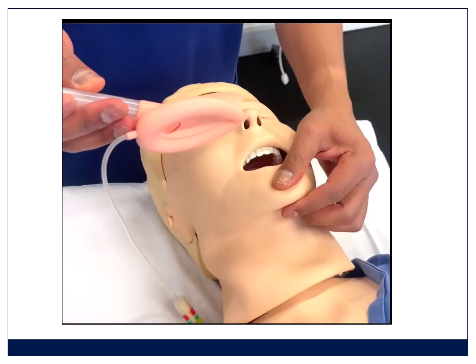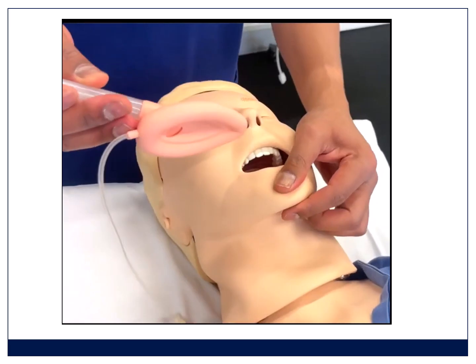Finally, as a rescue technique, if you haven't managed to get the endotracheal tube in, you need to know how to insert an LMA or a supraglottic airway device. Tips here to help is that you lubricate the back of that supraglottic airway device. Usually we don't have it fully inflated, but we also don't fully deflate it. We leave a little bit of air in the LMA, and then you can watch here the insertion technique.